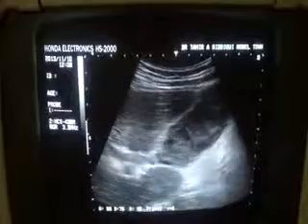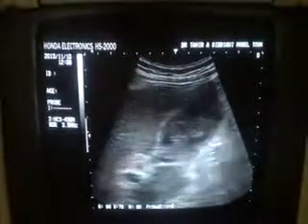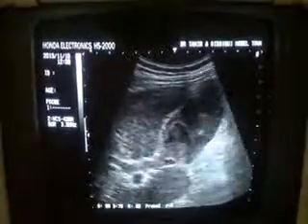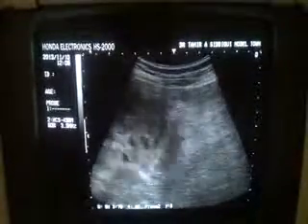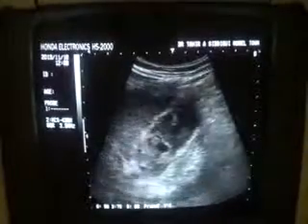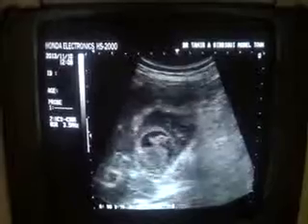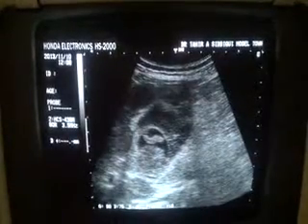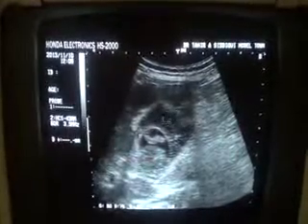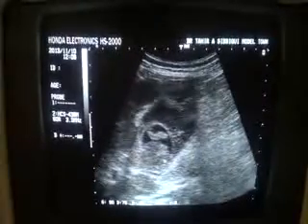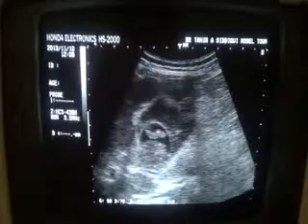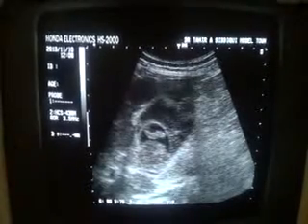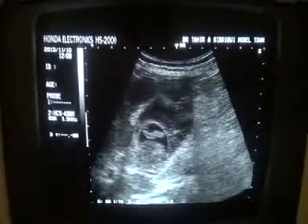So, with thick gallbladder wall, thick debris, fixed and layered echogenic material within the lumen of the gallbladder, this is very much consistent with gallbladder pathology — unless proven otherwise. Here you can see it gives a cystic appearance within the gallbladder. This is a cystic area within the lumen. With fluid, this is an echogenic area — a non-shadowing echogenic area. No calcification is seen. The outline is relatively irregular.